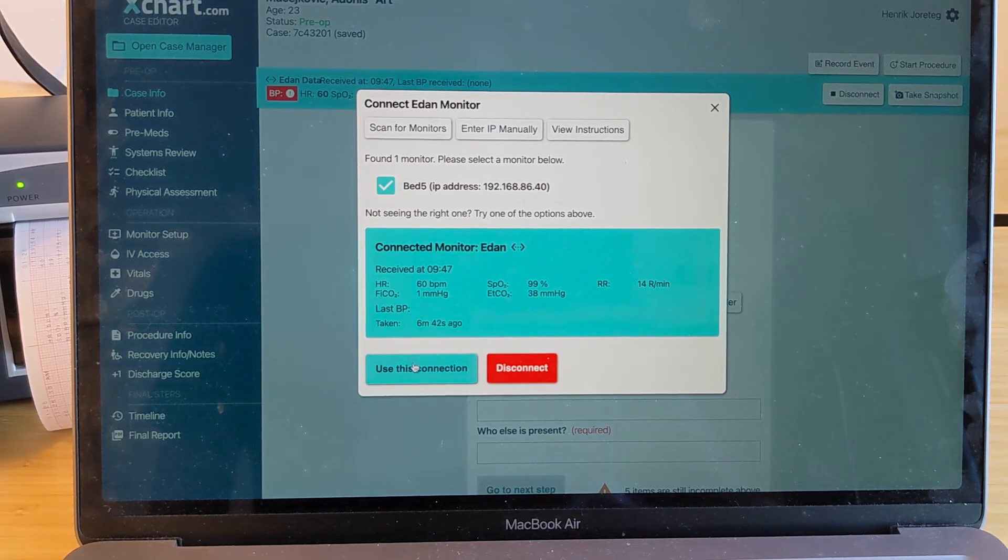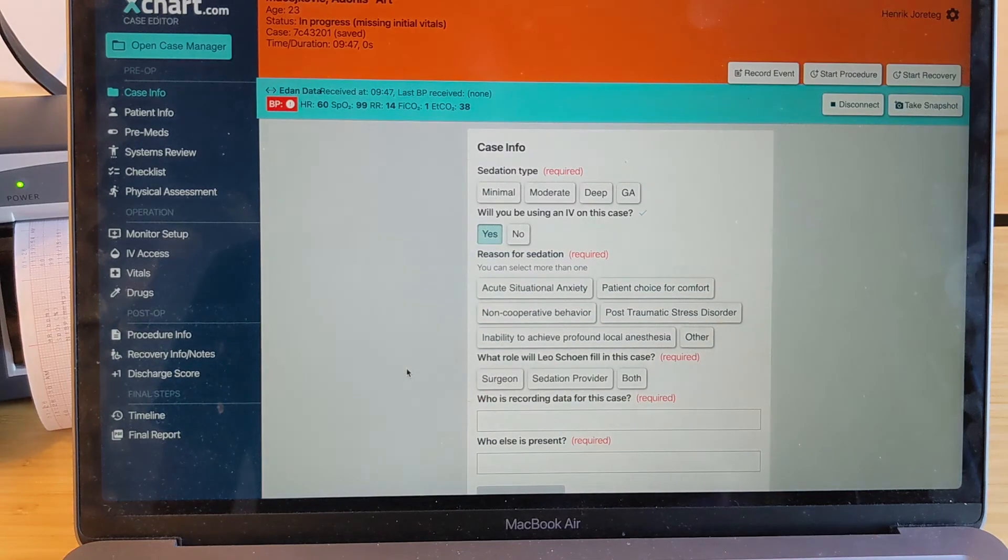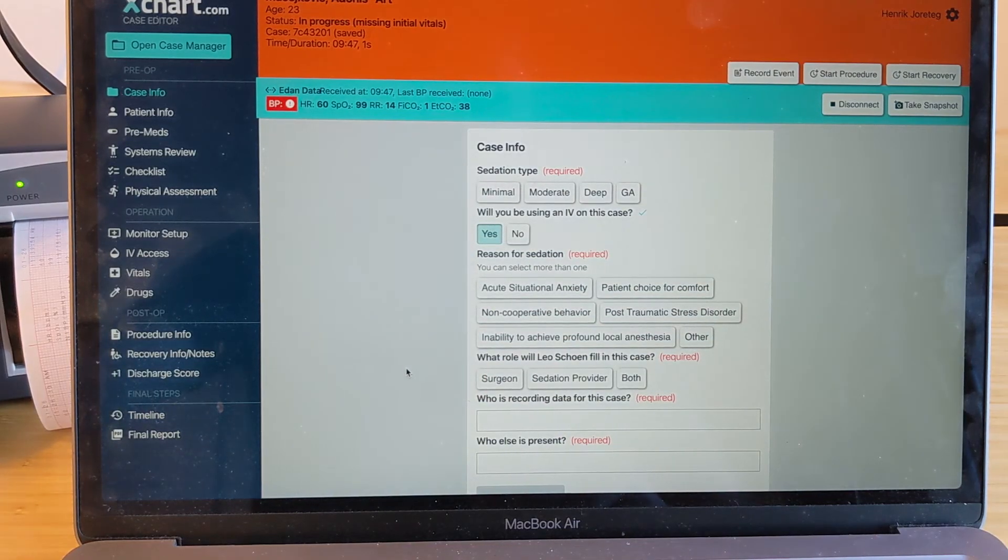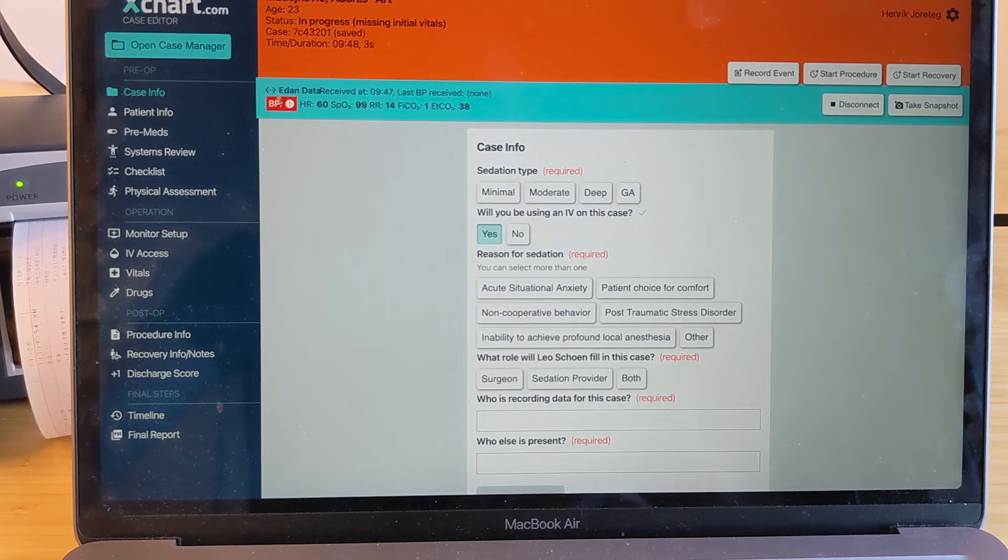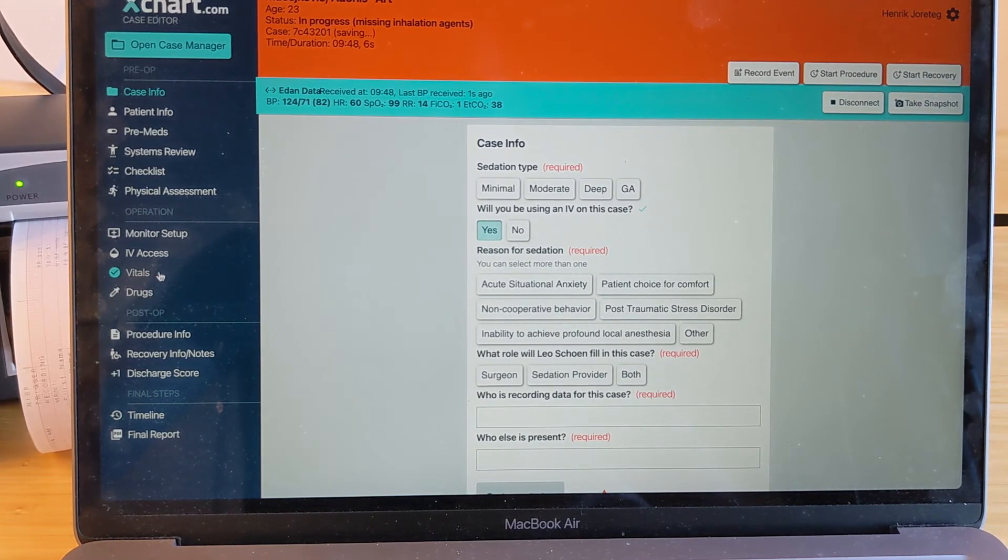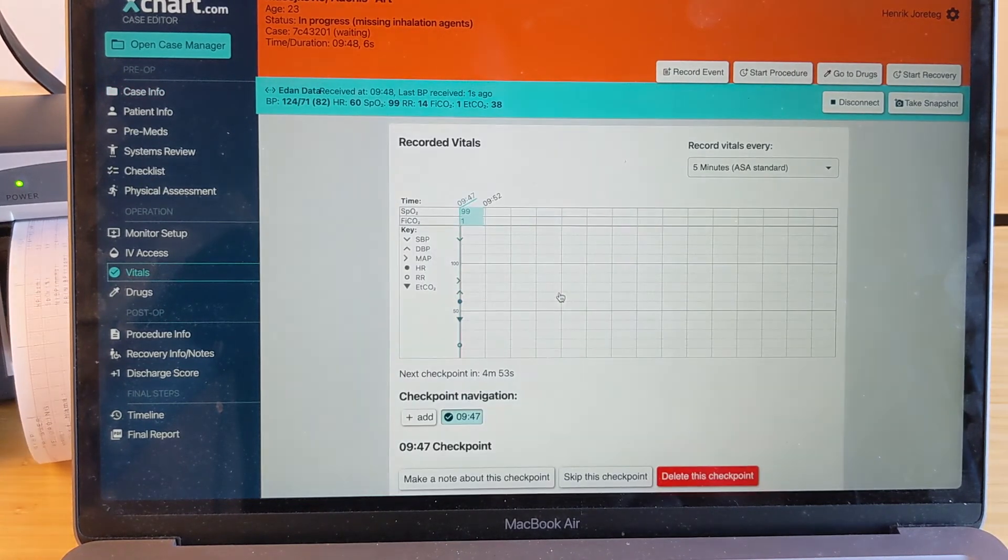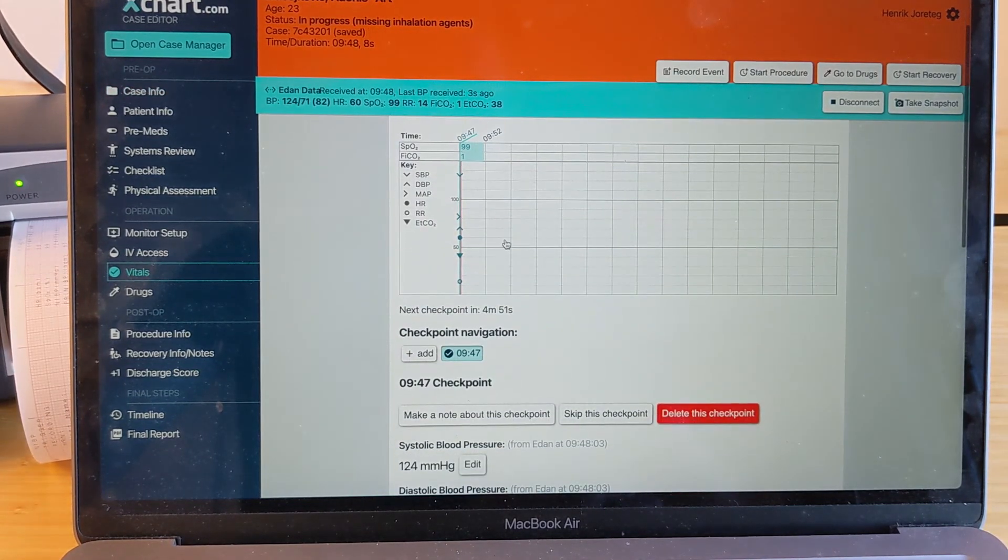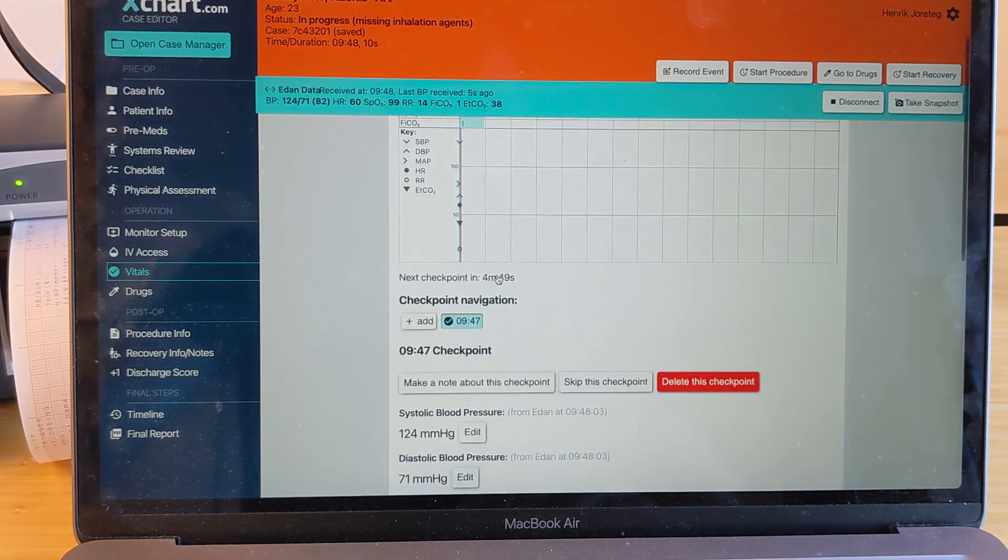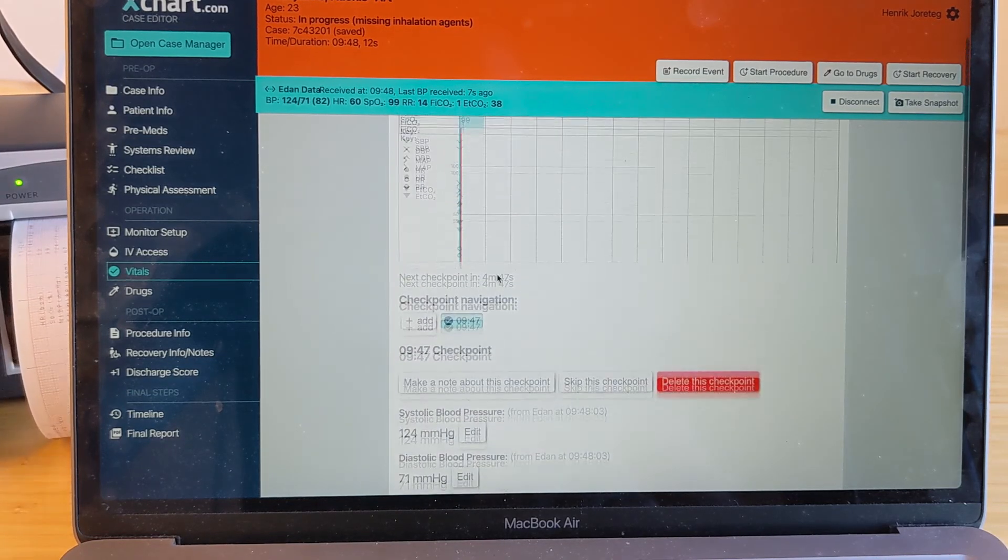But at this point, we're good to go. So if I hit use this connection, really, that's it. I'm going to hit take a BP over here just to get a BP value here. But at this point, we go to the vitals page. You can see that the first set of vitals has been recorded. The clock is ticking on the case here.